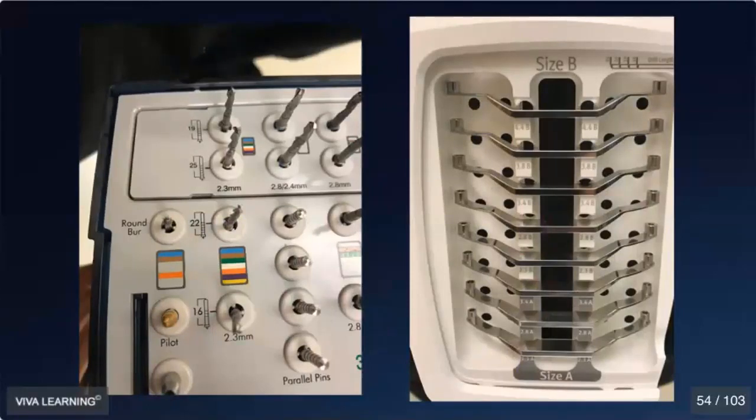The first and most important thing is, what is the length of your drills? It's possible that you can get around even having to know these things, because the software can default to set settings. If you put in a certain implant length, then there is, in some cases, for some implant systems, an implant drill length that corresponds to that. However, sometimes we want some flexibility. So in this case, we have 2 guided drills and 2 non-guided drills. However, all the drills are the same. So you have the advantage of having 4 different drill length options that you can choose from for any given implant. When is this important?